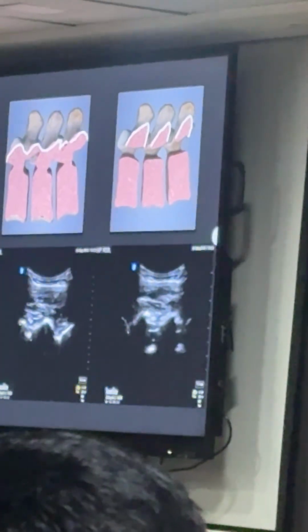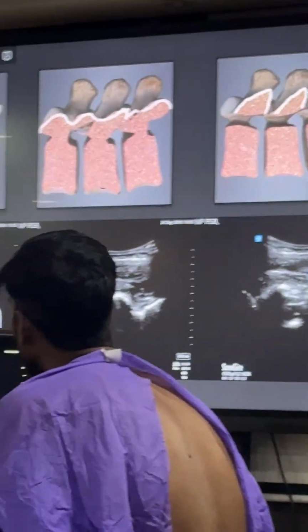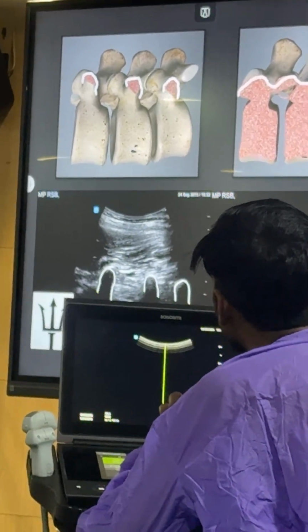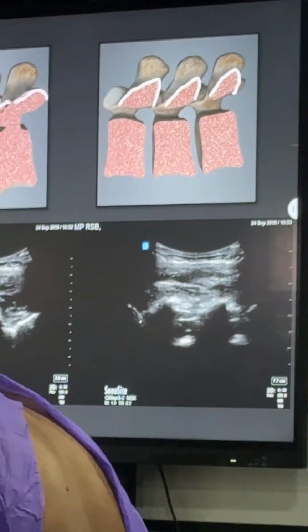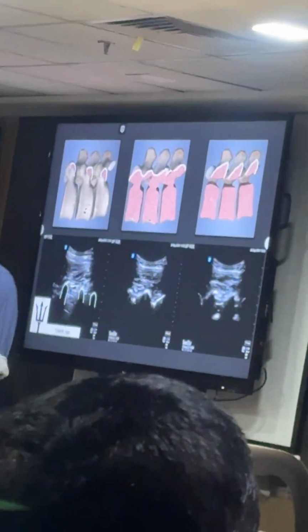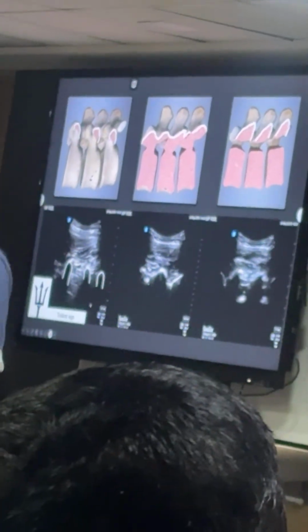So I'm going to propose many pattern recognition terminologies. In spinal sonography, we are still in a pattern recognition zone. In general ultrasound, we have risen above it; we now identify the individual elements themselves. But in spinal sonography, all of us still have to mature and understand; we are still in the phase of pattern recognition. So I am going to give a name for this. Since it looks like a trident, we are calling it a trident sign.